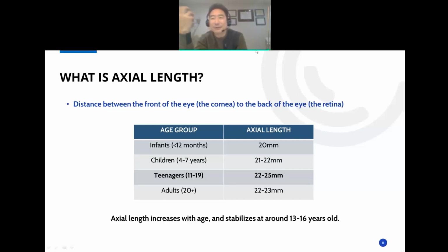But nowadays with all the new lenses, all the ones that you can design, you can control any curve you want, and it actually sits on the eye and molds much quicker, the side effects are actually very low. The only thing you probably want to be aware of is that if you're planning to do laser eye surgery down the road, you probably want to be off Ortho-K for at least a year. Depending on how long you wore it, but you want to be off at least a year, so that way you get the most accurate results for your LASIK or PRK. But in terms of long-term side effects, if it's done properly, the side effects are usually very rare.